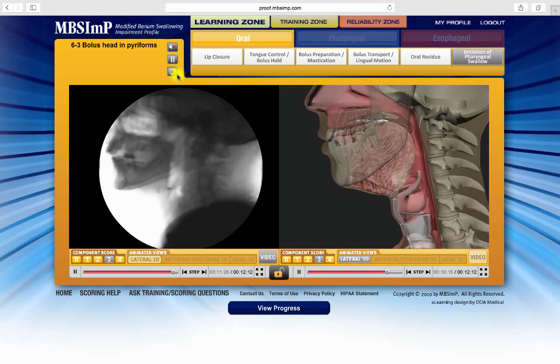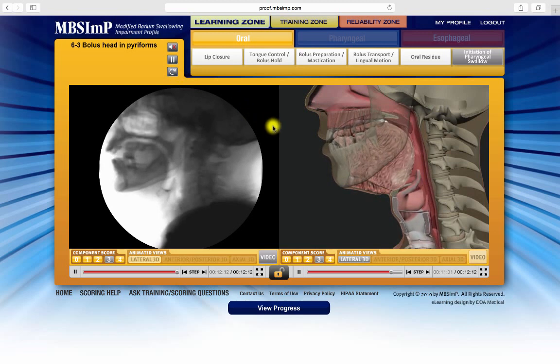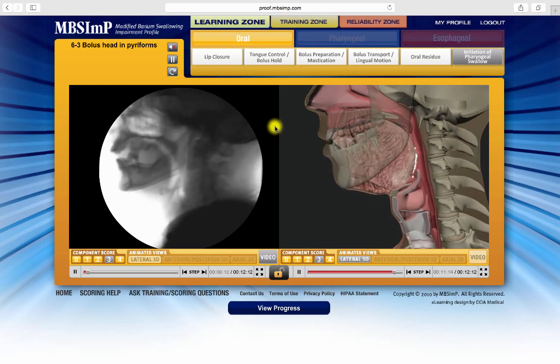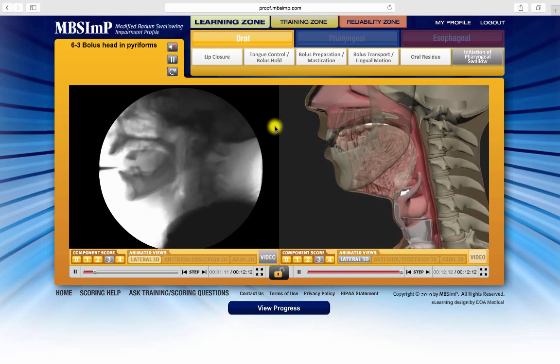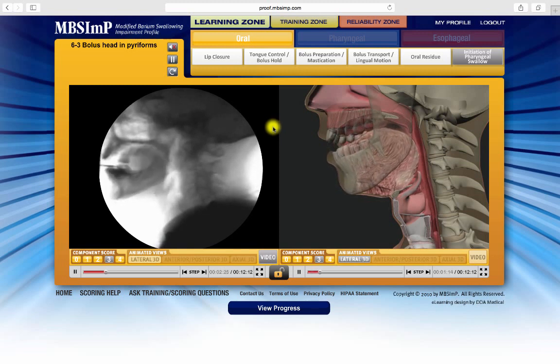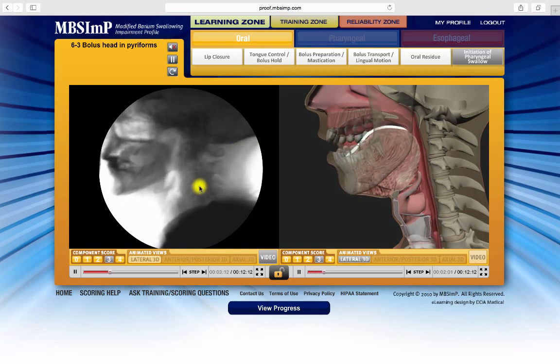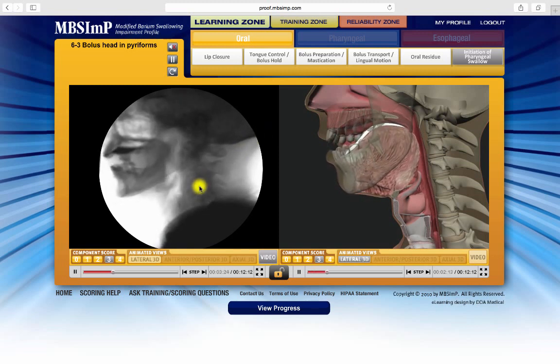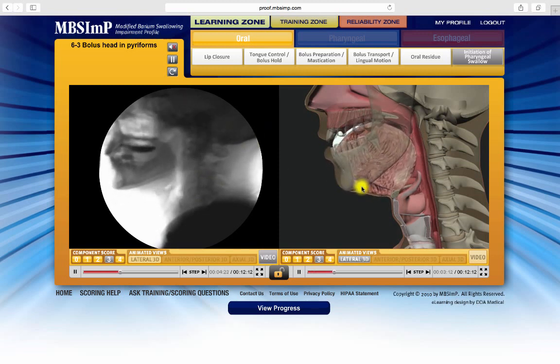The Learning Zone is designed with two media windows that, by default, function independently. The fluoroscopy example is in the left window, the animation in the right.